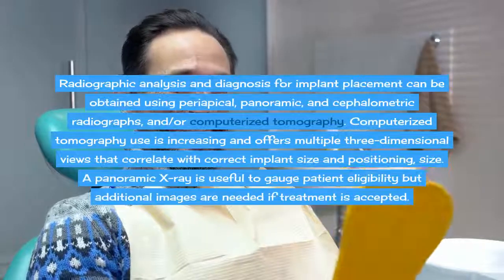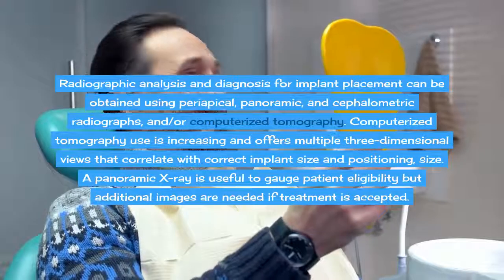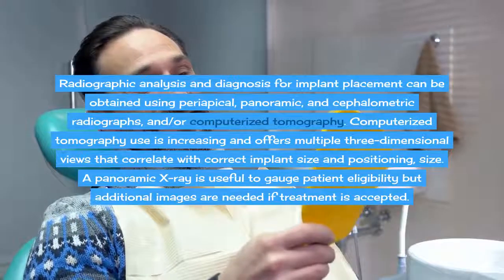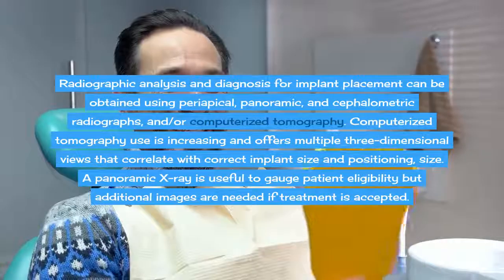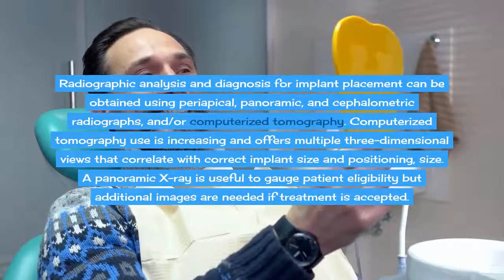Step 3. Obtaining images for diagnosis and treatment. Radiographic analysis and diagnosis for implant placement can be obtained using periapical, panoramic, and cephalometric radiographs, and/or computerized tomography. Computerized tomography use is increasing and offers multiple three-dimensional views that correlate with correct implant size and positioning. A panoramic X-ray is useful to gauge patient eligibility, but additional images are needed if treatment is accepted.